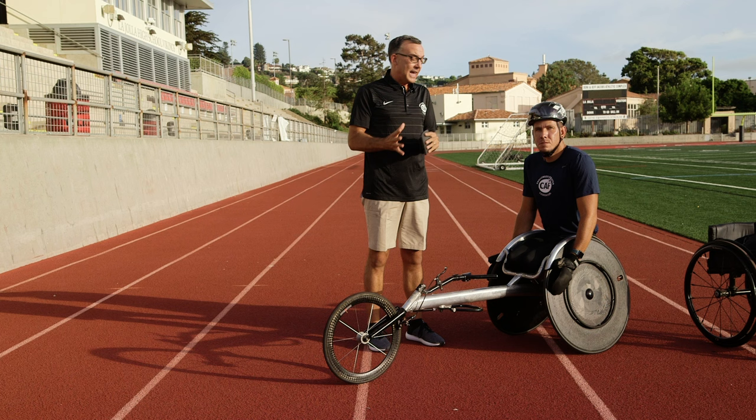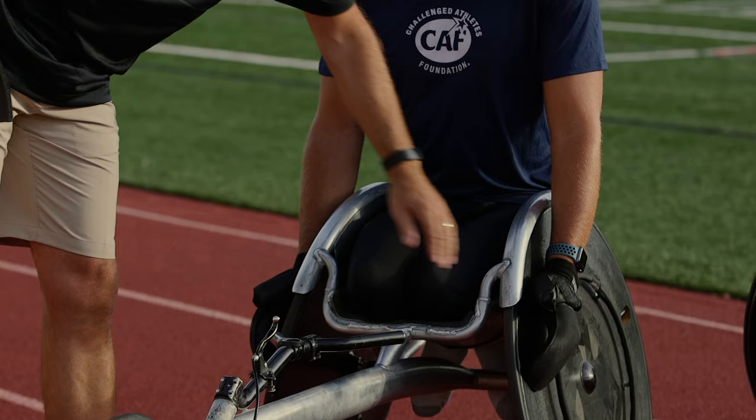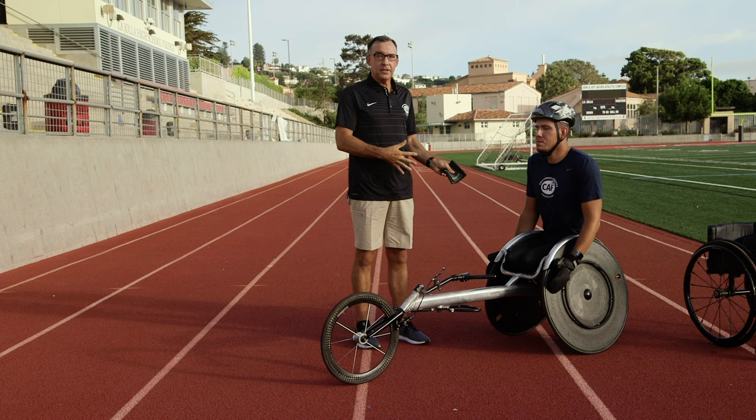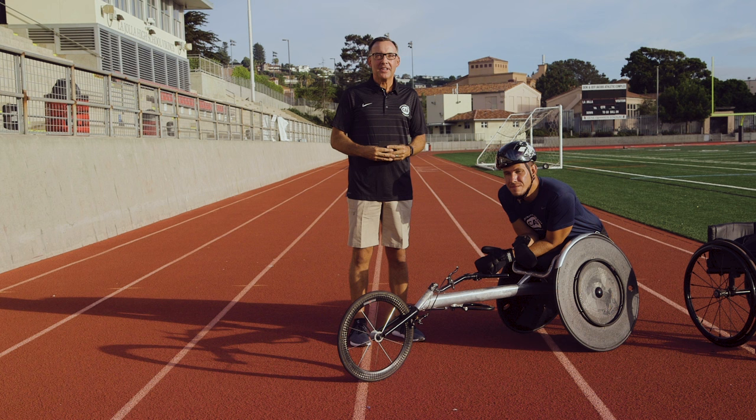You can also use yoga mats for the areas that don't need as much padding but still need protection, and that keeps the athlete safe and comfortable. When the athlete is first getting used to a chair, it's important — because they don't have sensation oftentimes, especially further down — that you take a good look at their legs, just to make sure there's no redness, bruising, or any abrasions so that they fit in their chair without harming themselves, because a lot of times they can't tell.